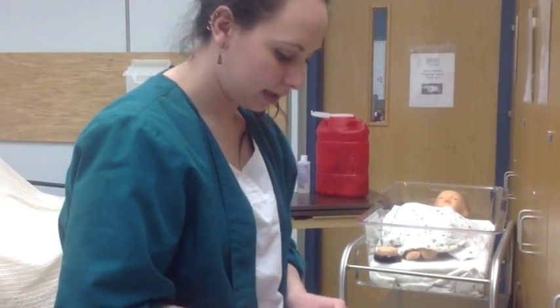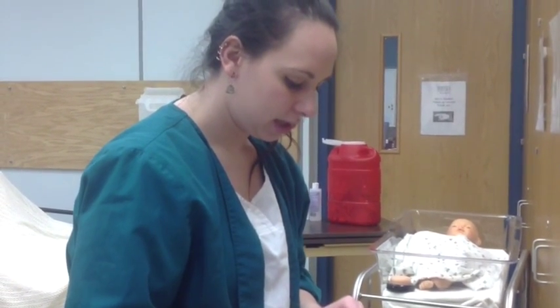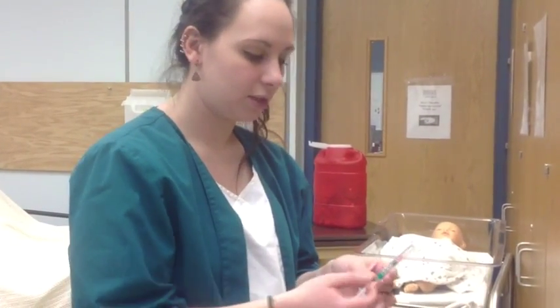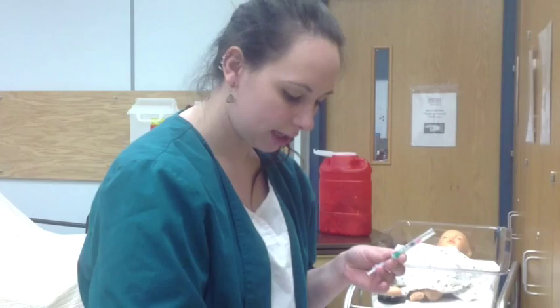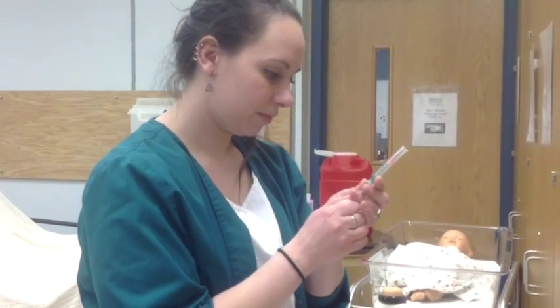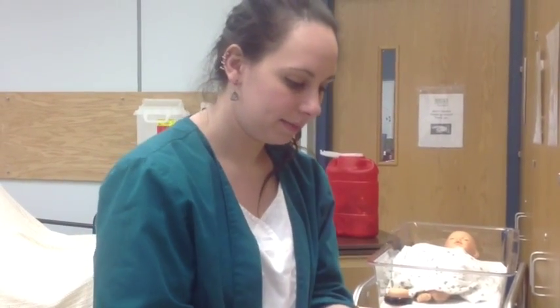So, I'm now going to open up the syringe. I'm going to take the cap off. I pull the shield up, my own personal preference. You don't pull all the way to the lock. I need to draw back air with the plunger to how much I need. So I need 0.5 mLs, so I'm going to pull back 0.5 mLs. Should I get it there? There you go. So, I have the right air.